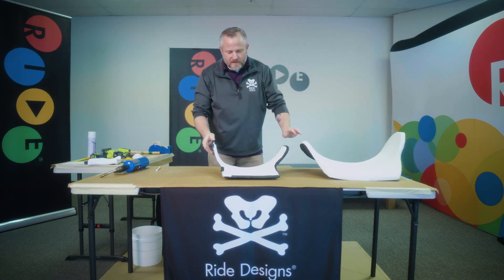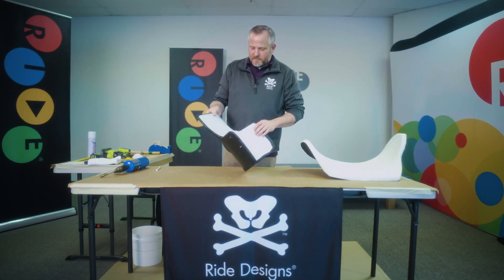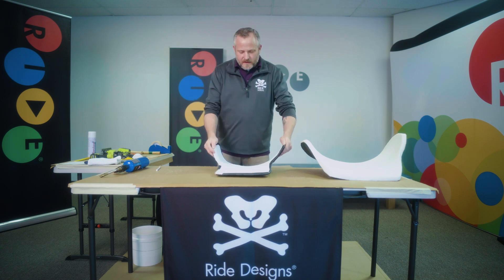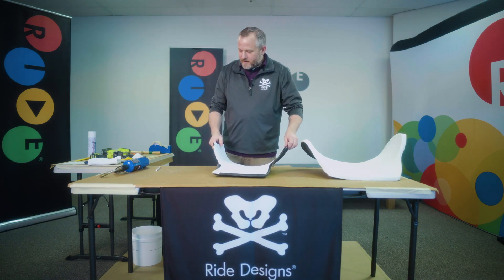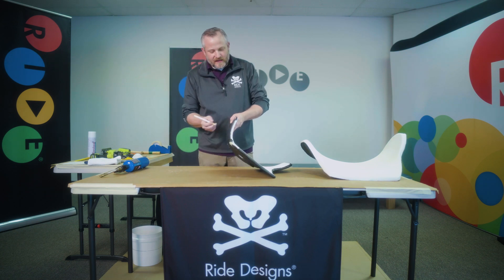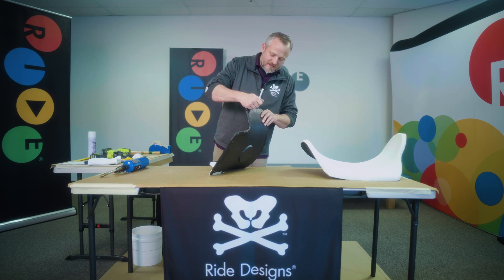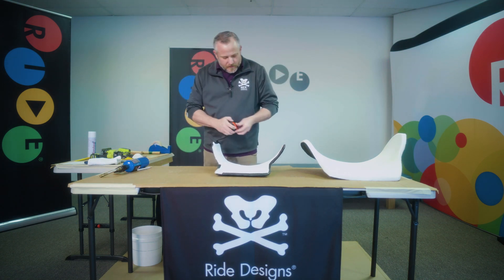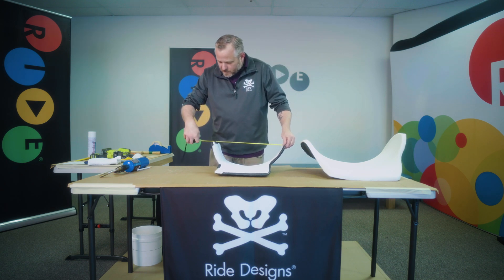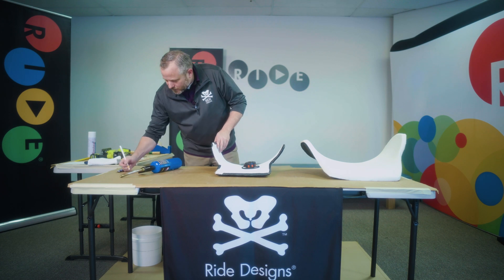We're going to use this one as the one we're going to heat and modify. First thing you want to do is take a preliminary measurement. You're going to measure from the outside of the lateral to the outside of the lateral, and you want to mark each lateral so that you're pretty consistent with where you're measuring. We've got 19 and a half — I'm going to jot that down.